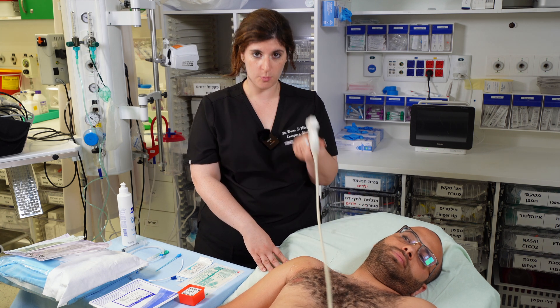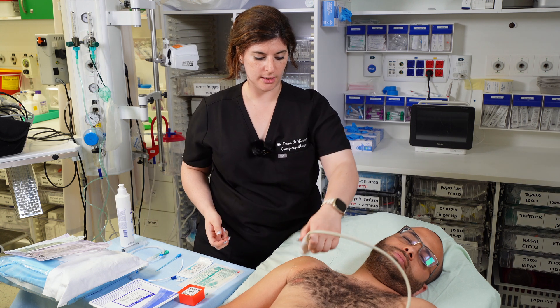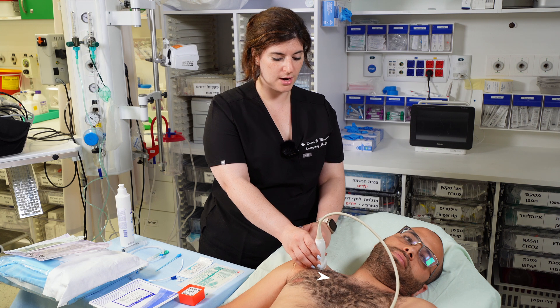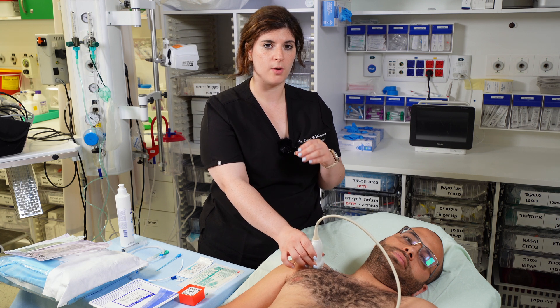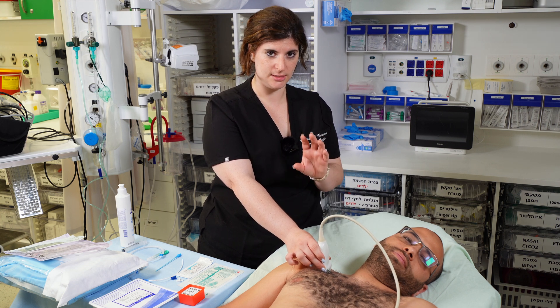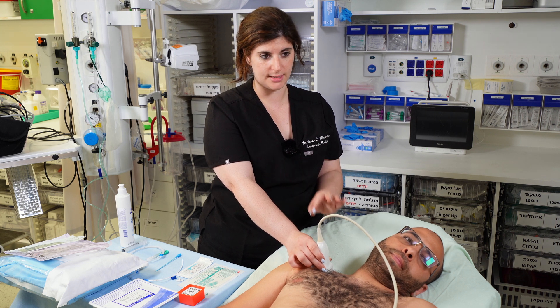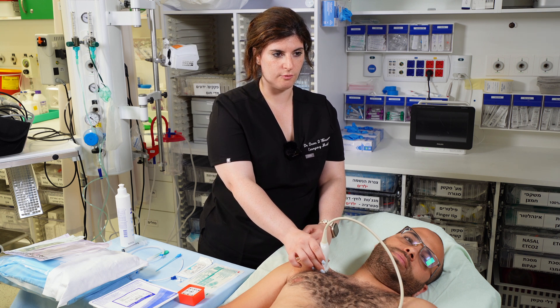Take your linear probe with enough gel and start looking. Begin distally, all the way out by the arm at the head of the humerus, and follow the clavicle proximally toward the sternal notch. You're looking for where the subclavian vein runs over the first rib, which gives you a landing spot that decreases the risk of going through the vein and puncturing the lung behind it.